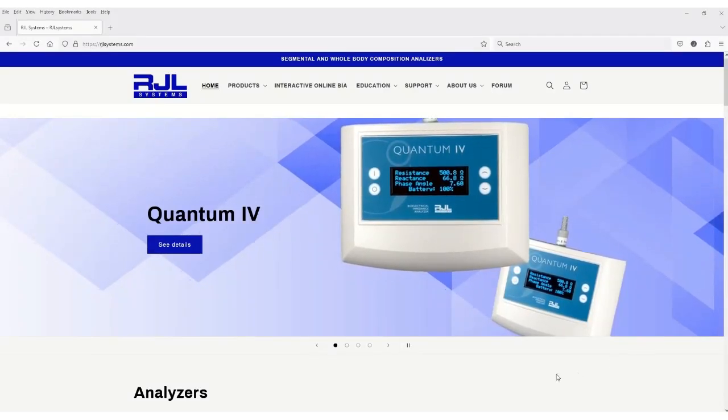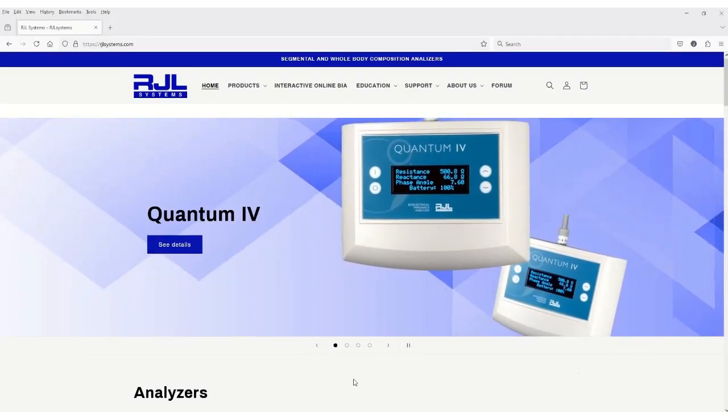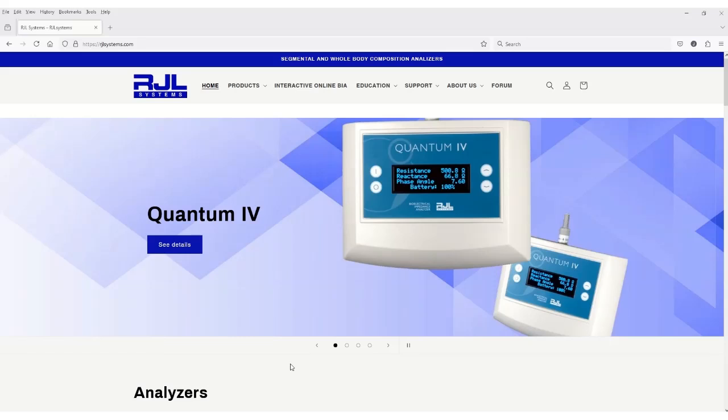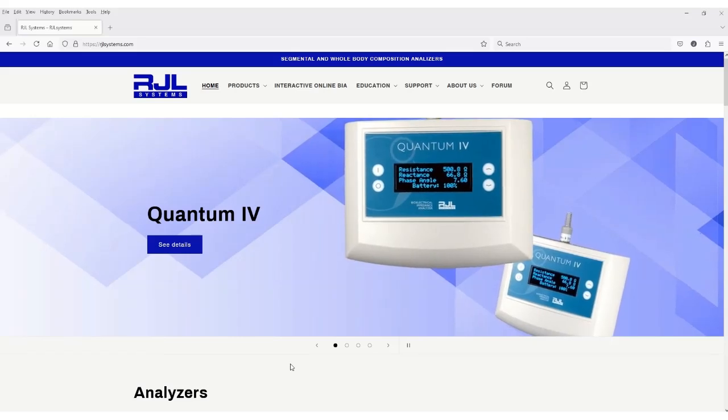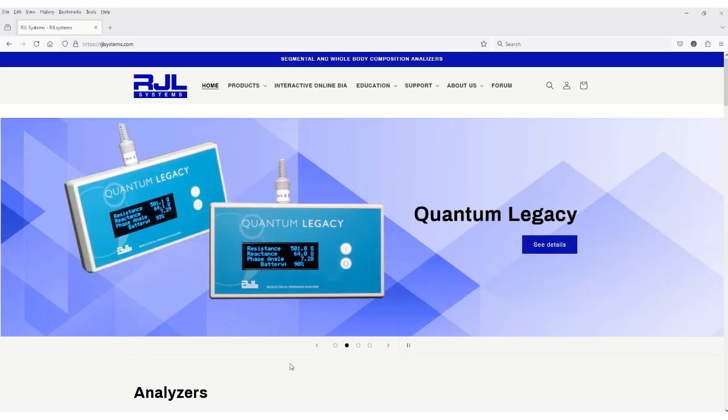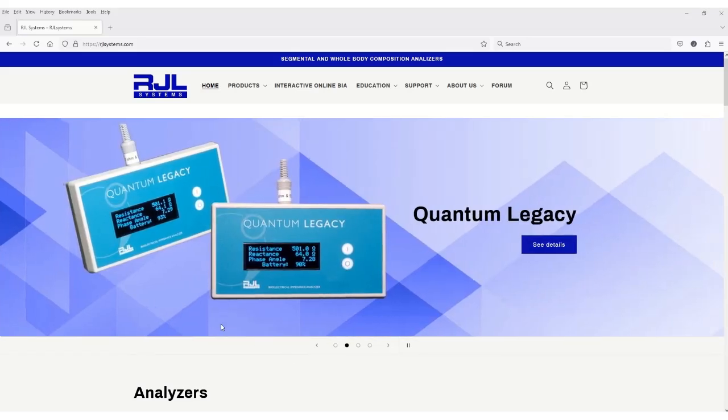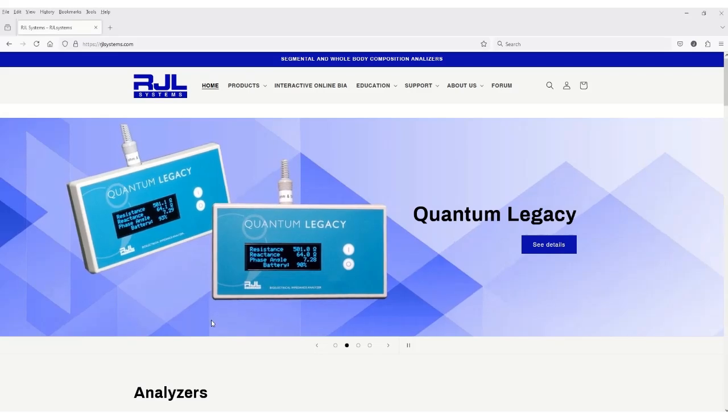If you are having trouble installing any RJL software program, this video will help you to install all body composition programs by RJL on a Windows computer.